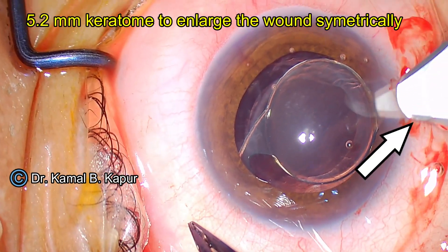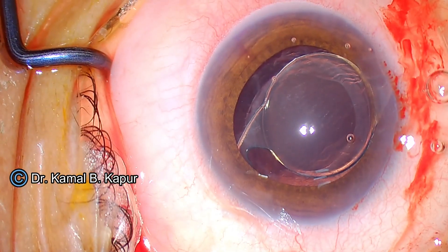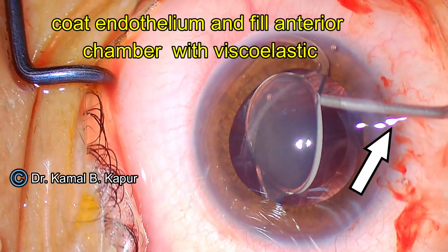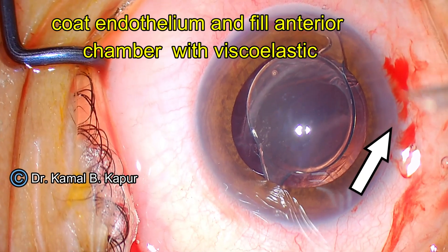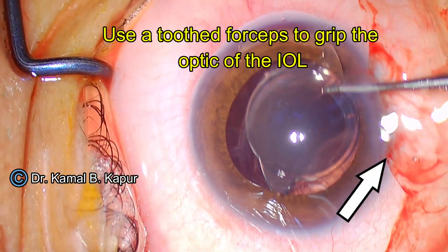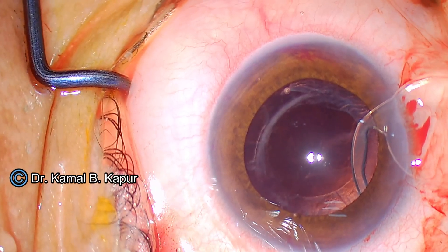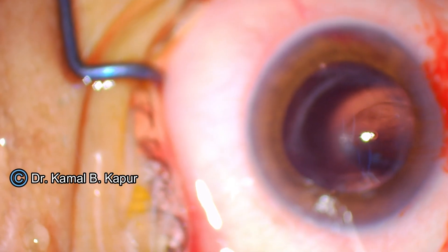Now the IOL has been delivered into the anterior chamber. I am using a very simple method to demonstrate this — I could have created a scleral tunnel which would have been more astigmatically neutral, but I am just using a 5.25 millimeter keratome, which is very easily available. Once the keratome makes the incision, I have nearly a 5.5 millimeter wound, and the foldable lens slowly compresses and comes out through the 5.25 millimeter incision very easily.